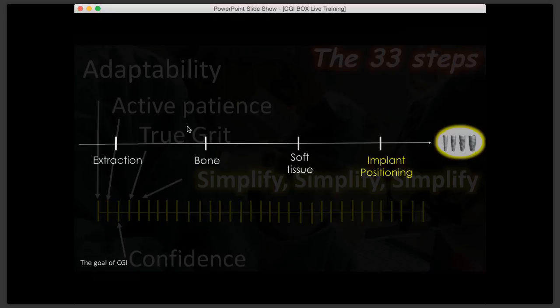That's super important. If you don't know that, then how are you going to plan your implants? Based on what? Based on what knowledge? So that's really critical. You have to know how many millimeters to stay away from the nerve, how close you can get to a tooth, how far implants need to be spaced from one another, the position of the platform, how deep subgingival, how deep subosseous. You need to know all these rules before you get into that.